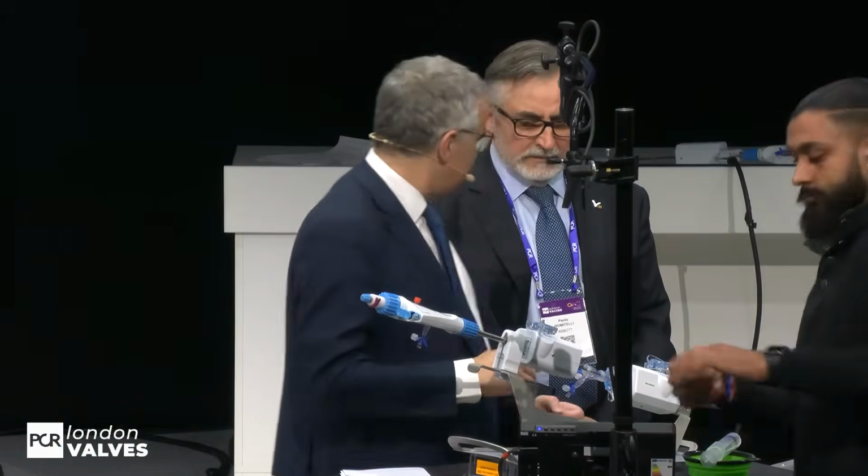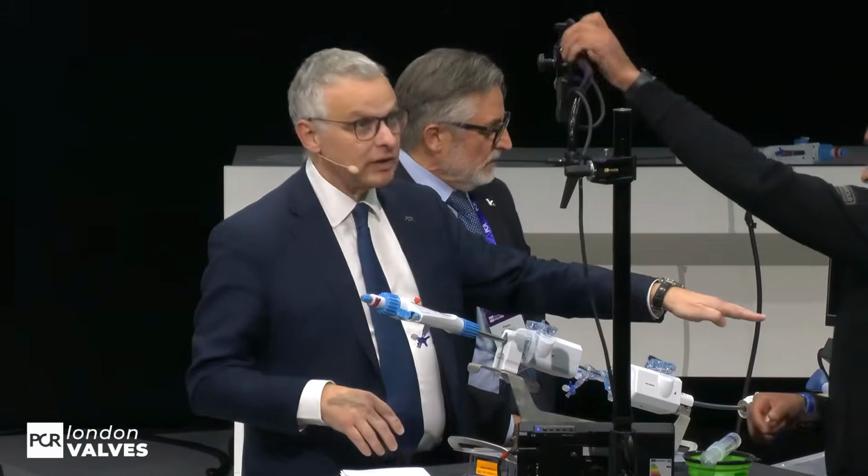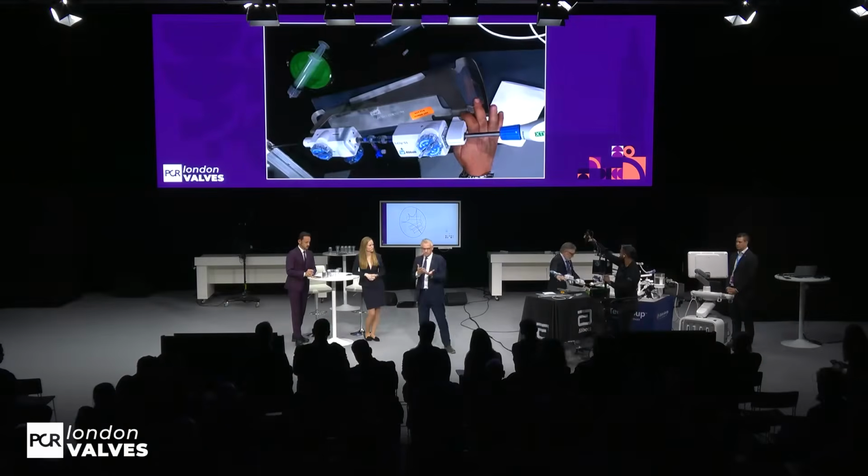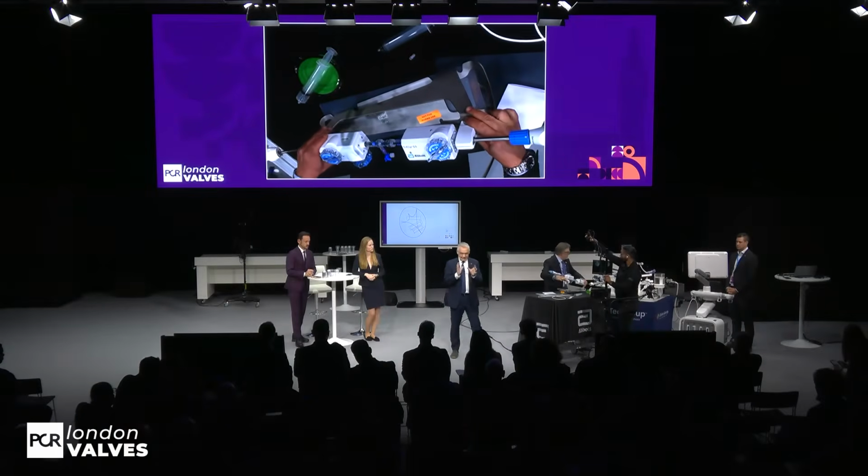The TriClip system is already in this simulator that you see here. This is the LifeTech simulator. In this room, we do a lot of simulations. We decided to use only this one because today we have a specific learning objective that I think we should share: we need to discuss the technicalities of going for anteroseptal only or posteroseptal.